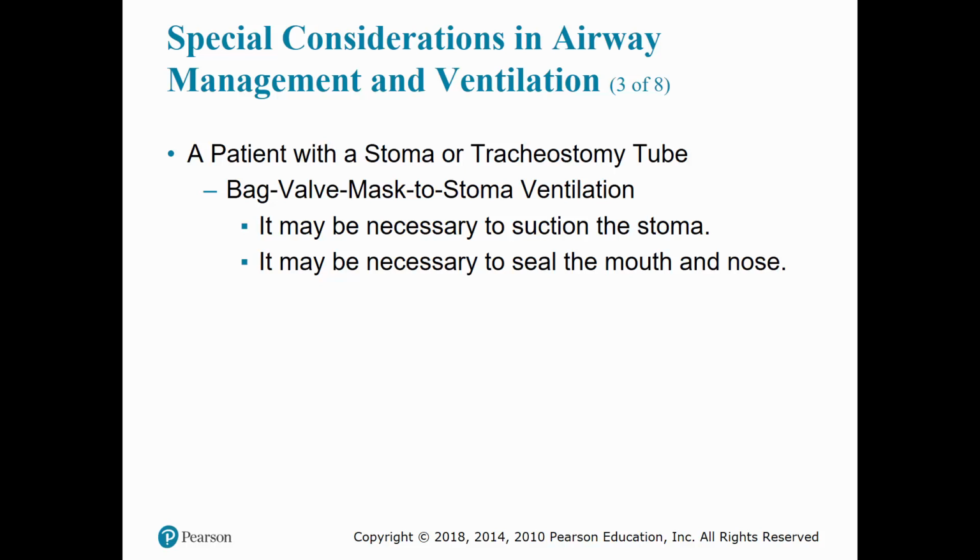When needing to ventilate the patient, make sure that you select a mask that will fit securely over the stoma. Usually this will be with either a child or infant mask. So you'll use a child or infant mask, but if it's an adult, you'll use an adult bag. With these patients, you'll squeeze the bag, delivering your ventilation over a 2-second period instead of a 1-second period. Make sure you're watching for adequate chest rise and fall, and feel to be sure that the air is escaping back through the stoma during exhalation.